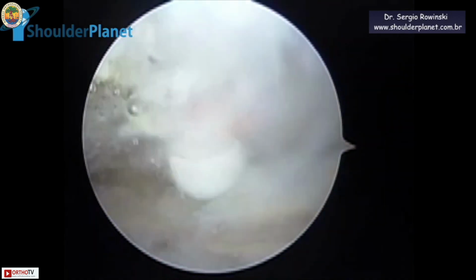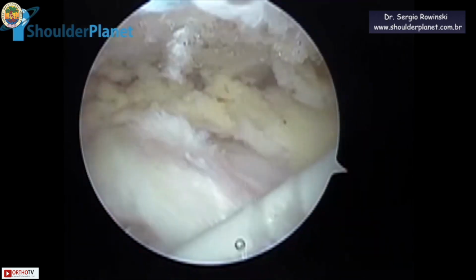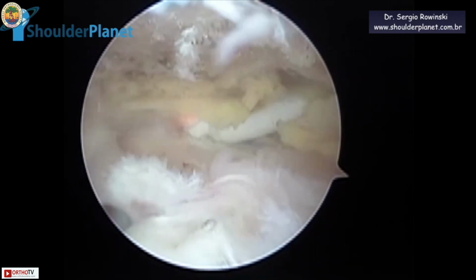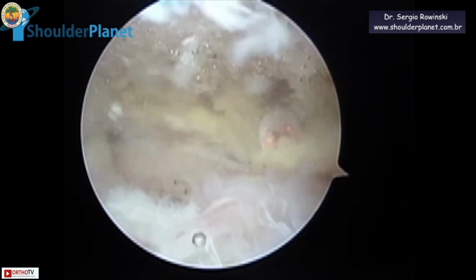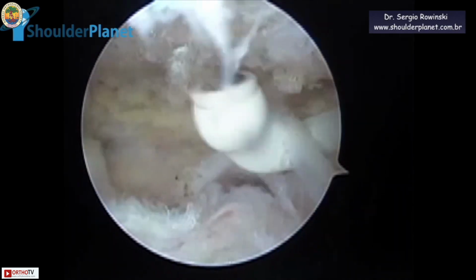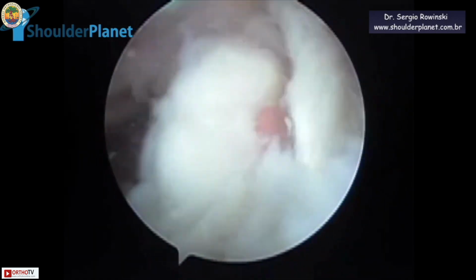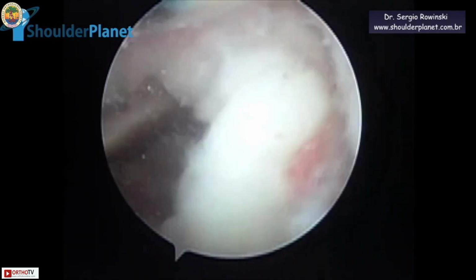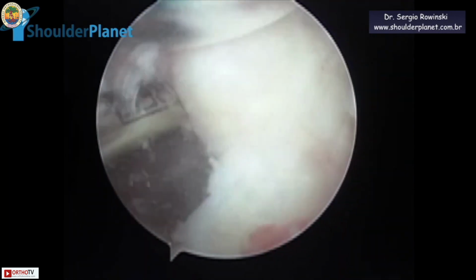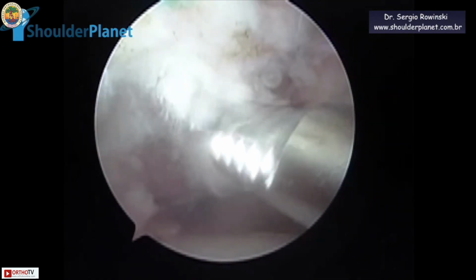We released all the adhesions between the cuff and the distal clavicle, and then we reassessed the tendon mobility, and we can even grasp the tendon, as we are seeing now, to have a better debridement of all the adherences. Then we entered with a small osteotome and released all the adherences between the inferior part of the posterior superior cuff and the superior part of the glenoid.